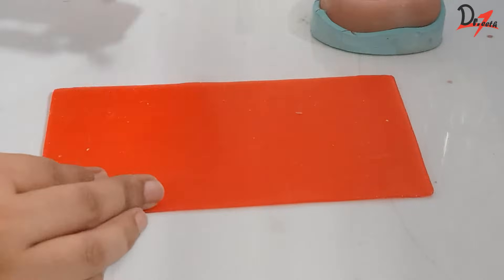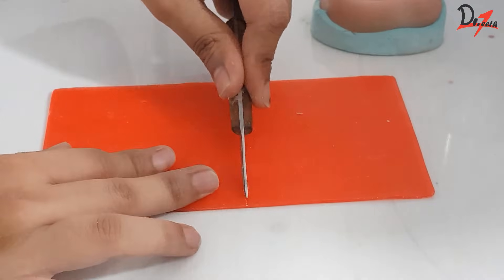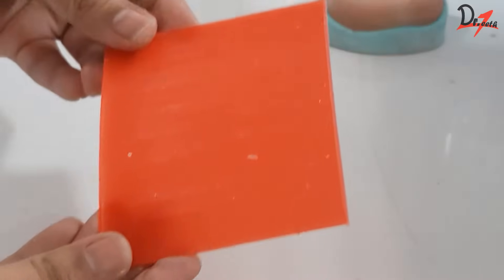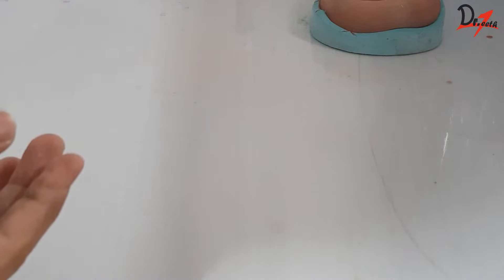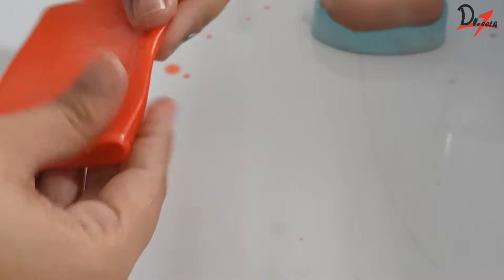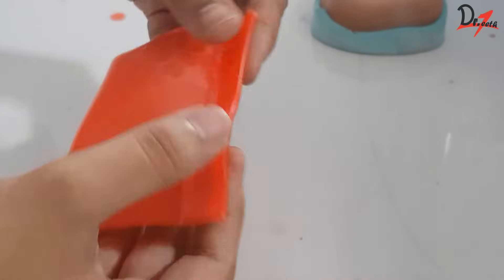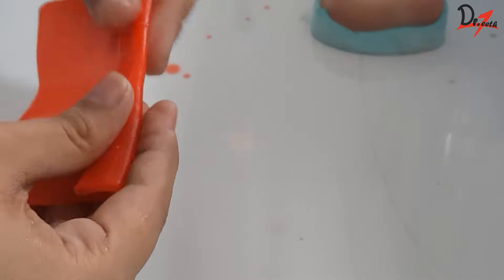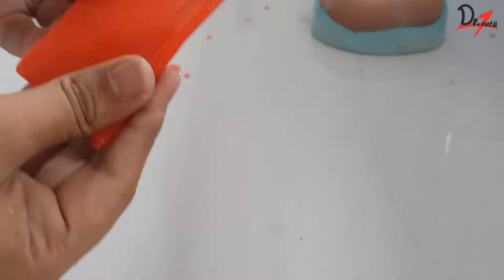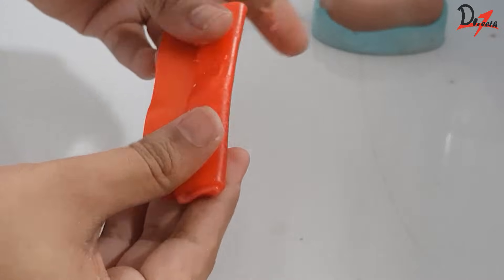Hello everyone, assalamu alaikum. We will start by taking a wax sheet and I am going to cut it from between — we can add or remove the excess later. I'm going to flame it up, as you can see in the reflection. I'm going to fold the wax sheet throughout, but make sure that after each folding you heat it up properly so that air does not get trapped inside. Otherwise our rim will look patchy, and of course we don't want that.